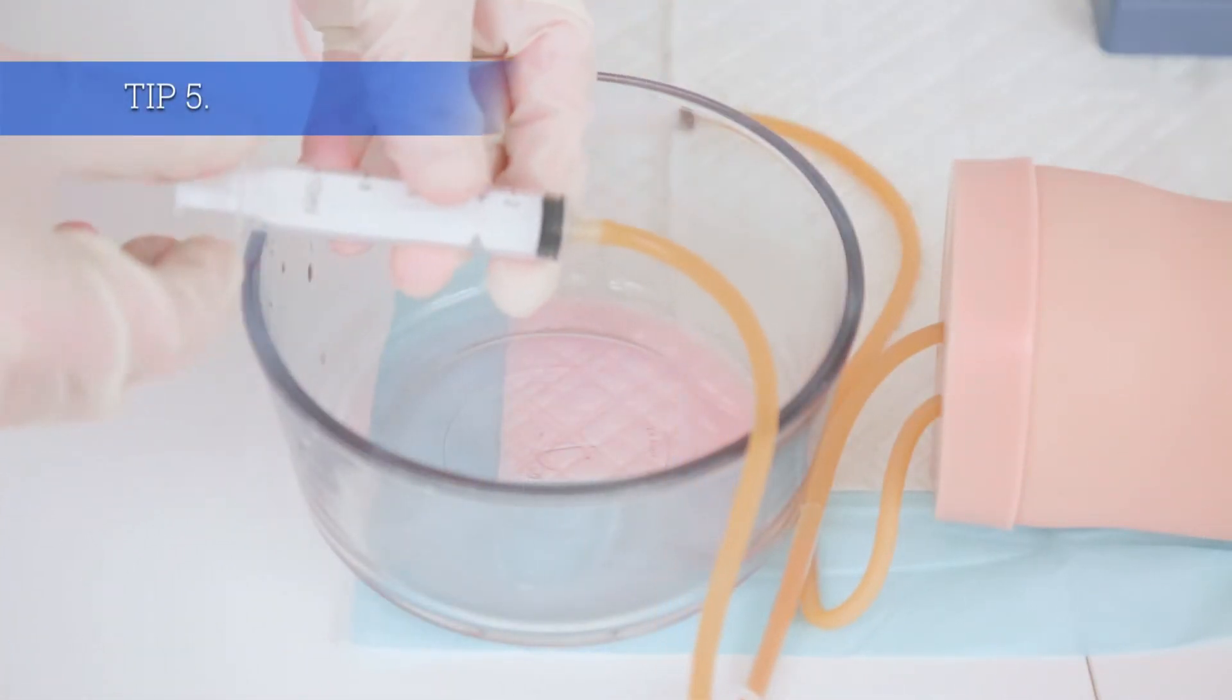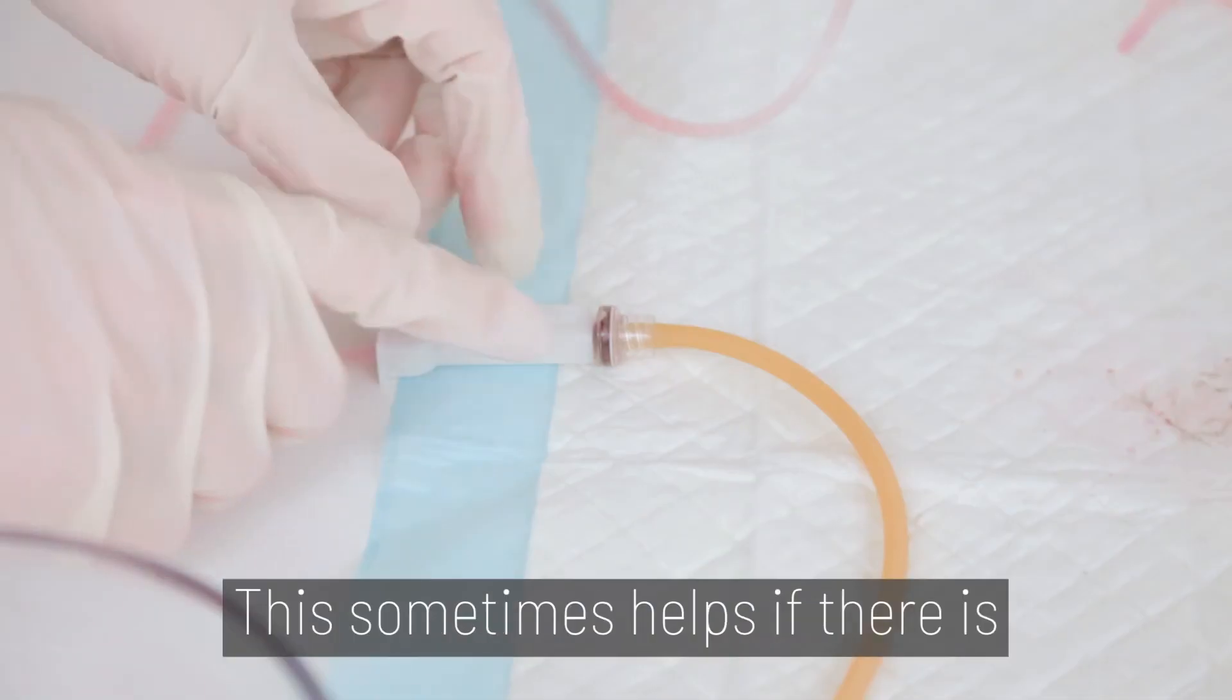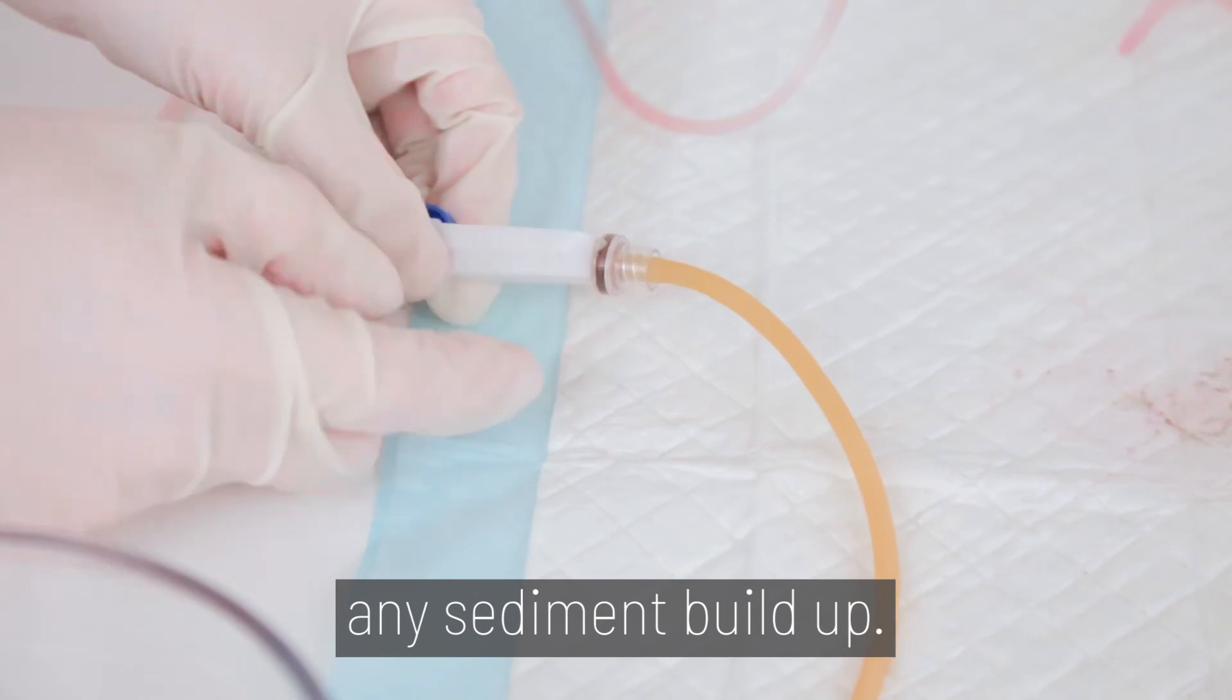Tip 5. You can also connect a syringe to the inlet or outlet tube to draw or pump blood through the model. This sometimes helps if there is any sediment buildup.